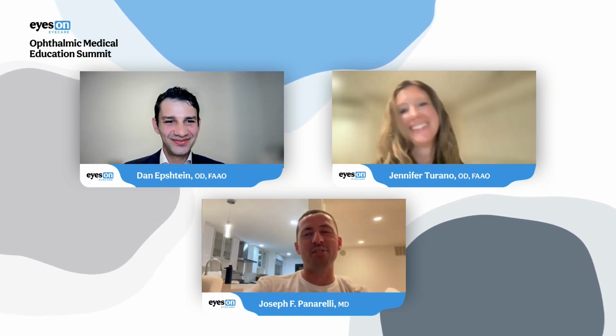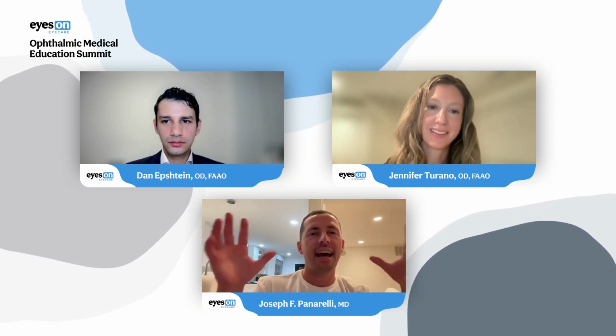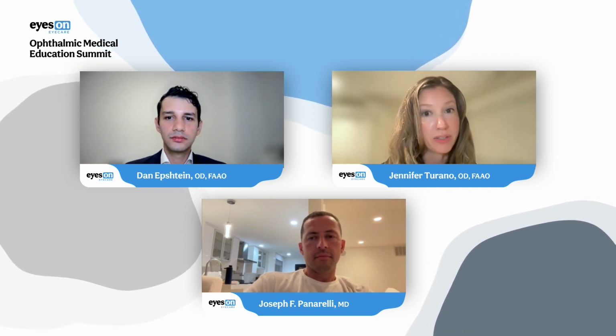In the last minute that we have, Jen, hit us. How often after an intervention are you retesting visual fields and OCT? I think that's the big money question from both of these cases. How often should we be testing our patients? Yes, I usually try to do it within about 3 months after their last intervention. One of my reasons for that is we know, especially with glaucoma surgery, there's a lot of fluctuation in vision in the first few weeks after surgery. So I try to give the eye some time, get that vision a little bit more stable before we retest and reset our baseline.